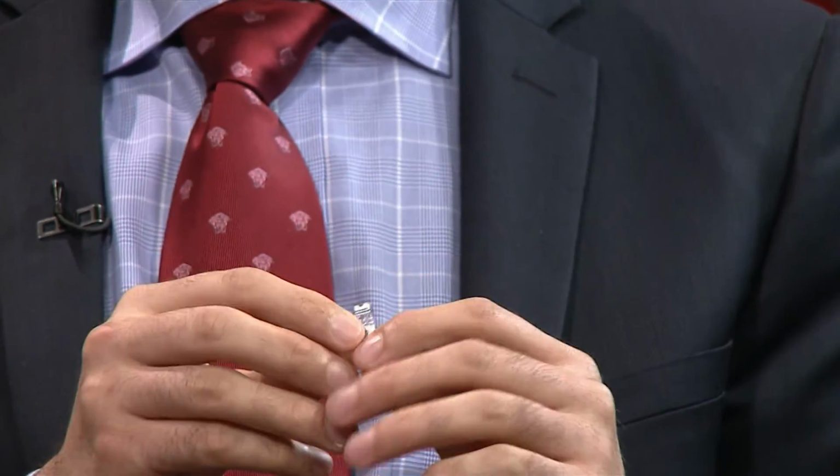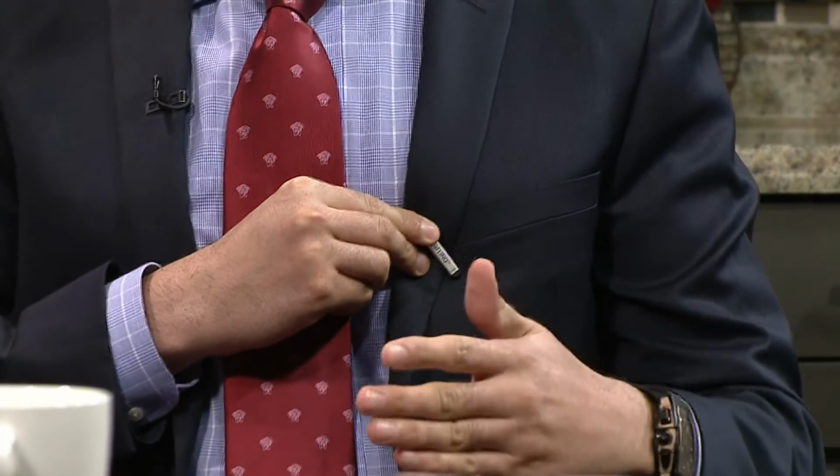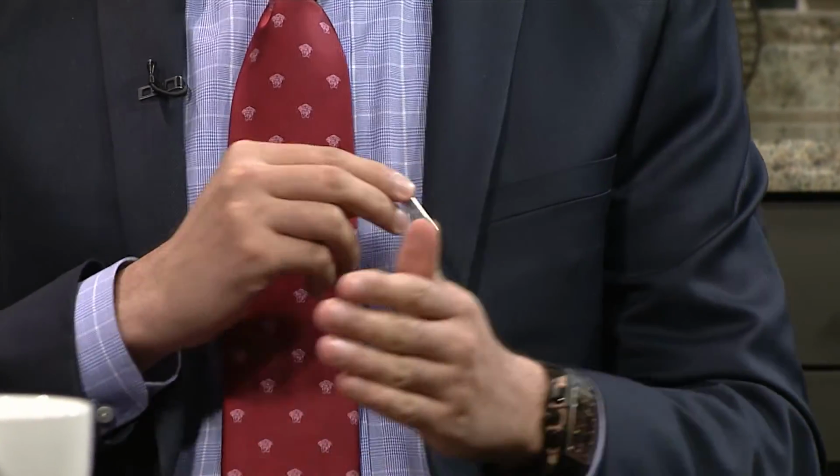Okay. So we have this device that's relatively new, where this takes about 10 seconds to implant. It's literally a chip. I tell my patients this is a chip. It's not a pacemaker. It's not a defibrillator. It's with a needle. We implant it here, and it has a battery in it that is good for about 2 years, where it constantly monitors your heart and tells us if you have irregular heartbeat. It tells us the cause of the stroke, it tells us the cause of your palpitations or any of those things if we cannot catch it with a regular Holter monitor. And then we can fix it, absolutely.